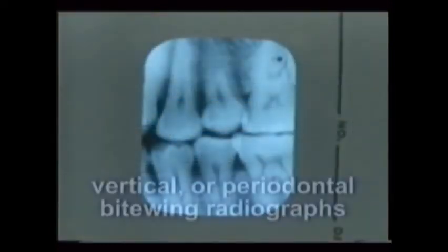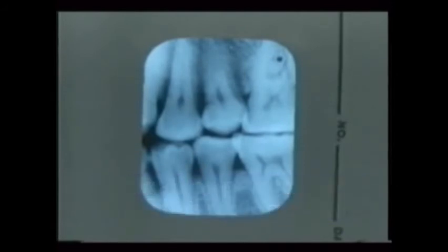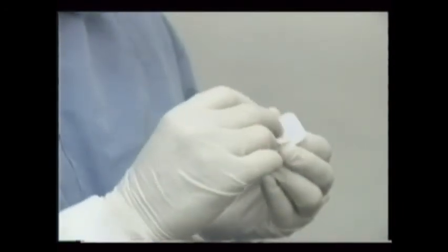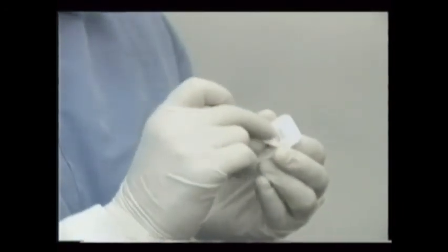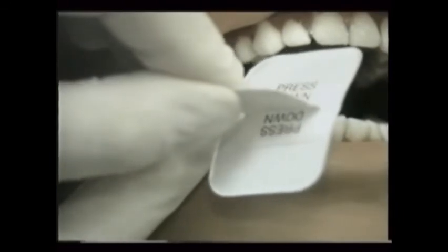Sometimes, though, when the bone loss is so great that its height is not seen on regular horizontally placed bite wings, vertically placed bite wings are needed. Appropriately, these are also known as periodontal bite wings. No new exposure technique is needed when making perio bite wings. Simply orient the film's long axis vertically, as shown being done here. Review the X-ray video for the basics of making periapical and panoral X-rays.